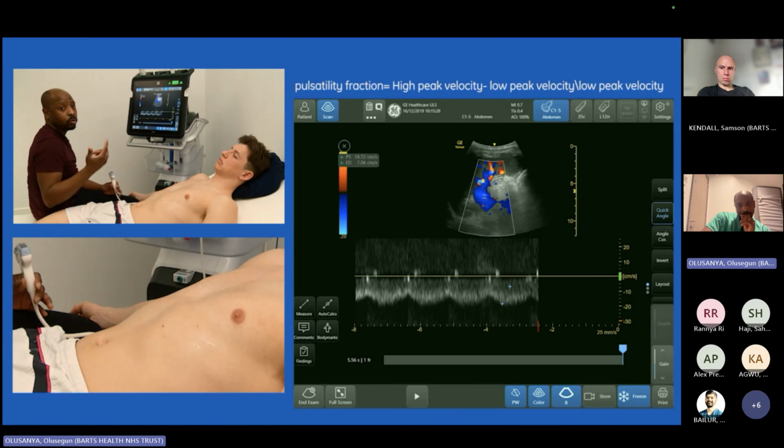There's the spleen. I'm going to go posteriorly to the stomach, and there you are, there's the left kidney. Just going to try and get a better picture. That's a little bit better. Turn a little bit towards me. Just turn a little bit like that. Perfect. Okay. So the first thing we want to do is get a nice full clear image of the organ in particular. So there's a nice image of the left kidney. We're going to pop color flow on.